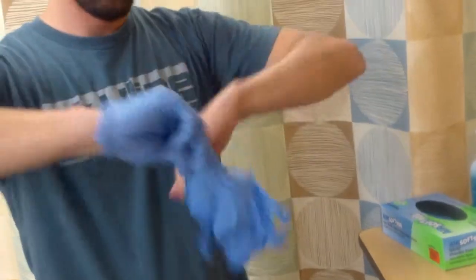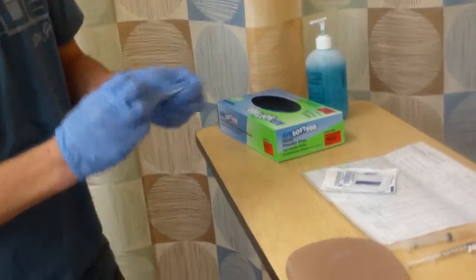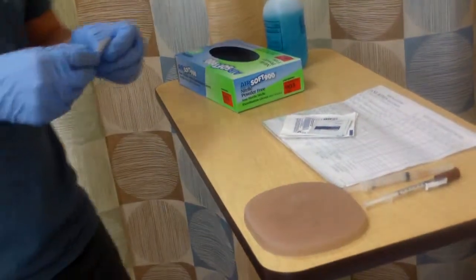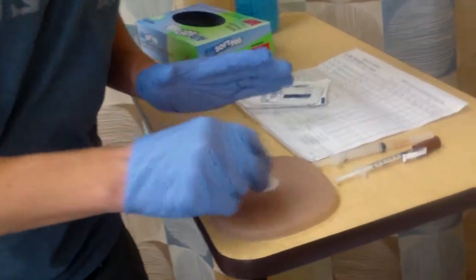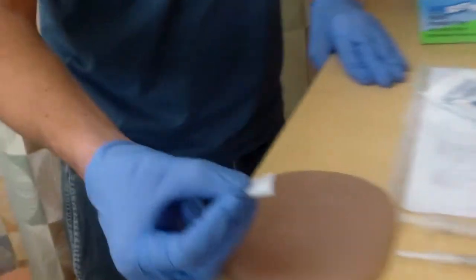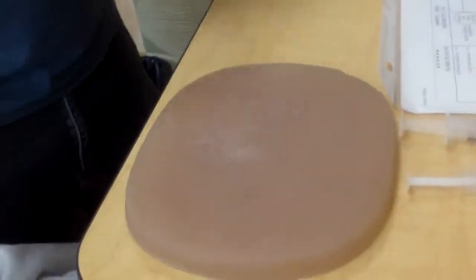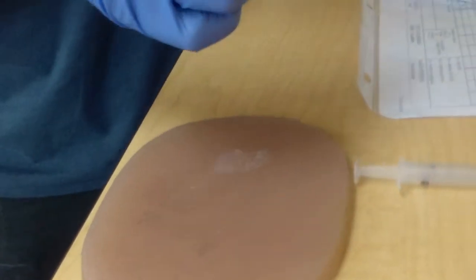Okay. So I need to do an alcohol prep on this. So I do that. So this is on the forearm. I've already showed you site finding, so I'm going to do the circle moving outward. I'll move this a little closer so you can see. Circle moving outward, okay. And then with my intradermal, I'm going to undo that.